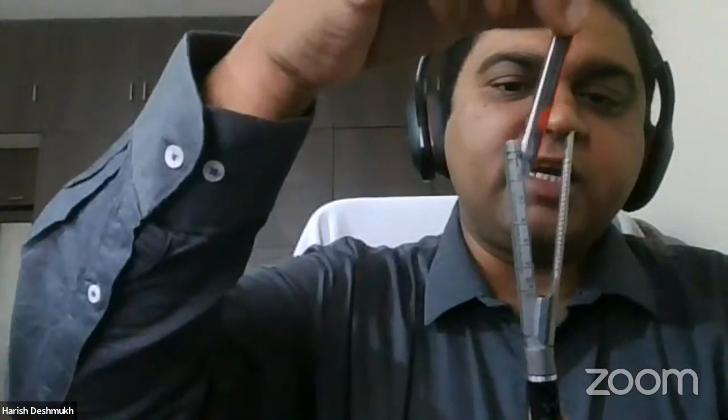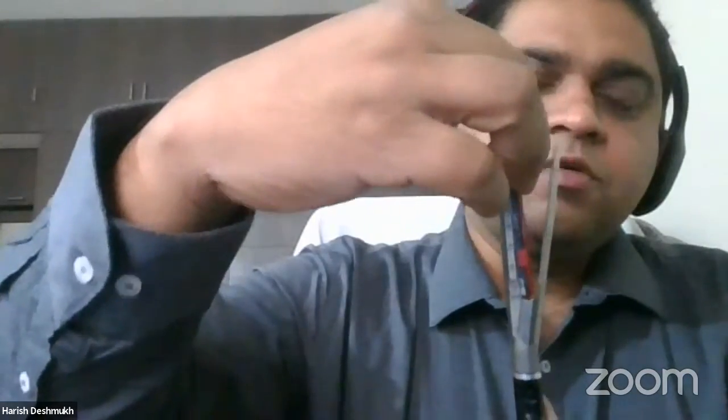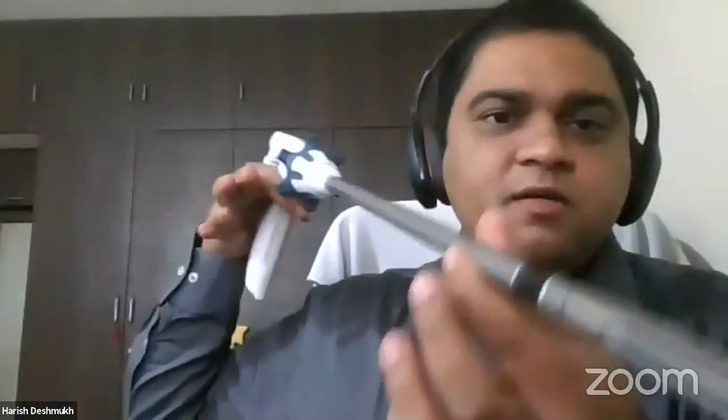So how to load or reload in this? This is how the reload comes to you, with the cap on and the stapler full. When it comes to loading, you slide it down at an angle of 30 degrees till the end of the stapler half, or the reload half. Push it and done. You'll have a click sound. After that, you remove the safety cap for firing, close the handle here, remove the safety lock, and fire.